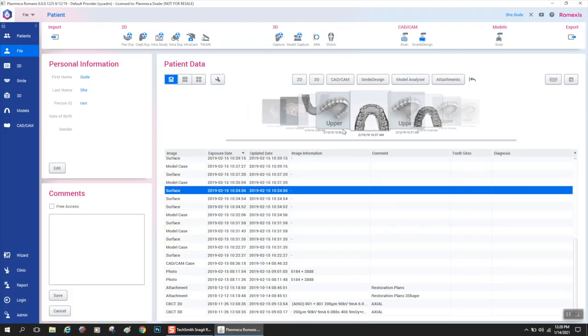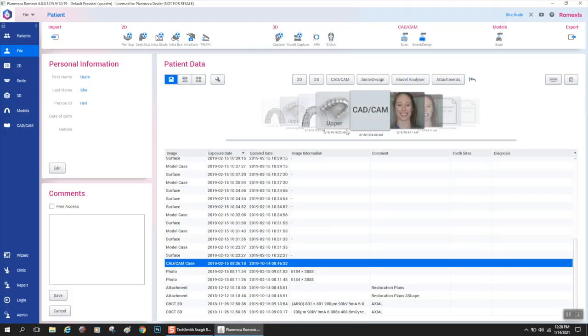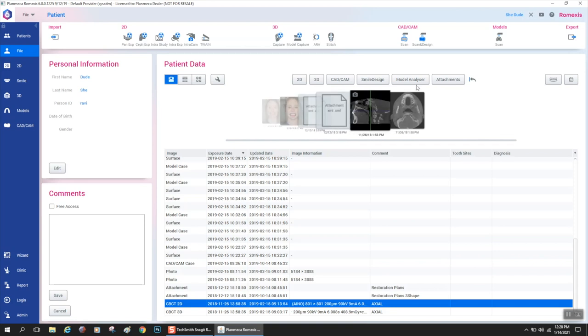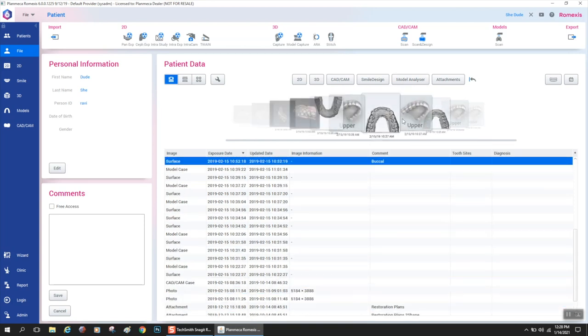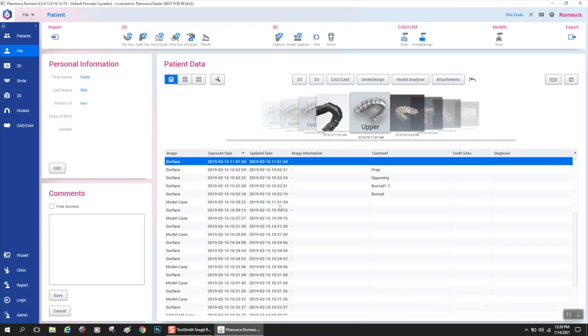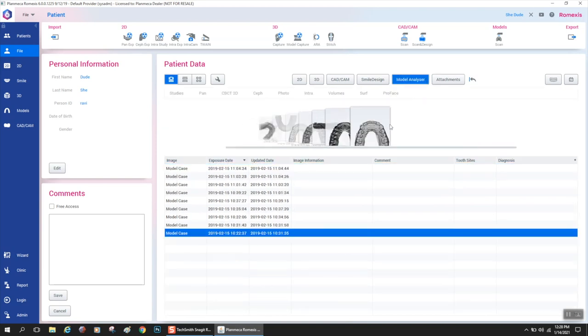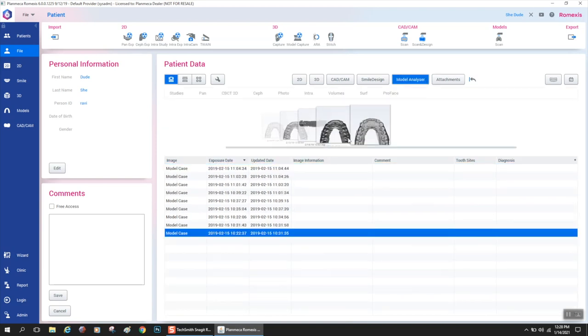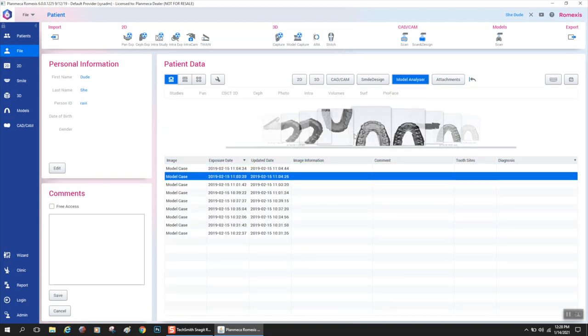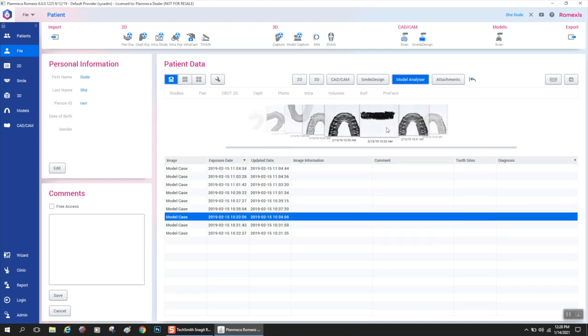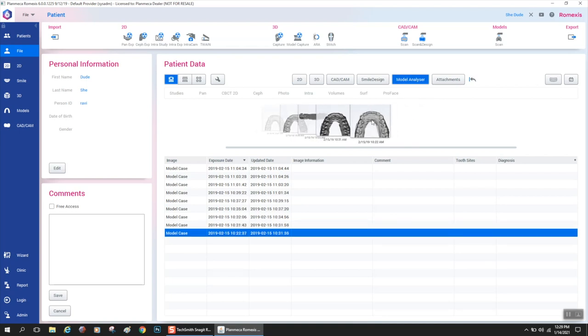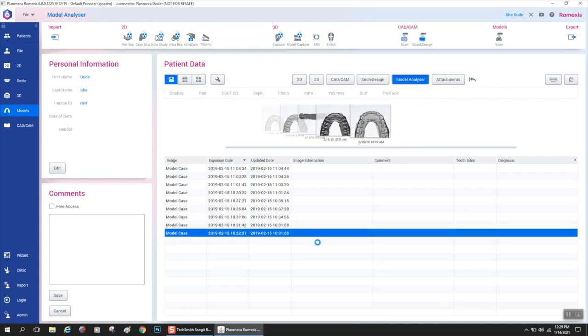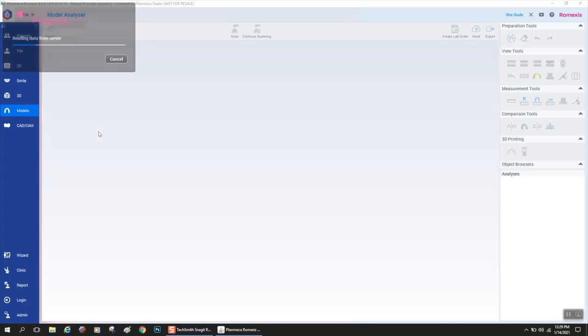So upon request you guys want to know about model analyzer. So here we are in Romexis 6 and I have a patient selected and all the information is there with that patient. I do have some model analyzer cases that I've done on this patient. All you need to get back in is double click the 3D file and it would instantly open up in model analyzer. That's one way you could get a 3D file into model analyzer.